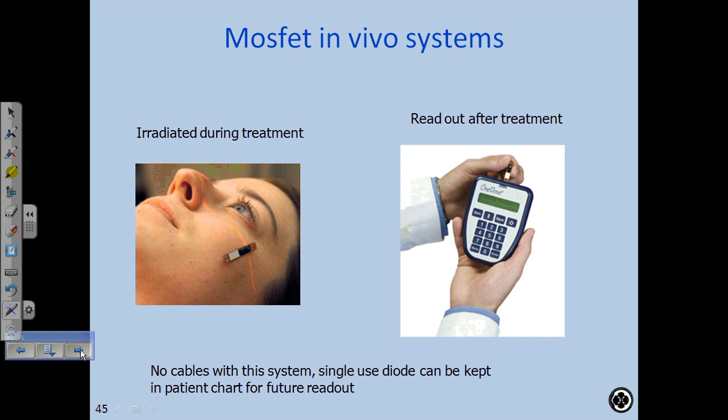And you can actually put the patient's MR number on there. There's a little memory chip. A little bit of memory, you put a patient's MR number, and then it stores the dose. And we used to keep those in the patient's charts. Okay, and you can reread that. Okay, so that's non-destructive as well. And this is called one dose.